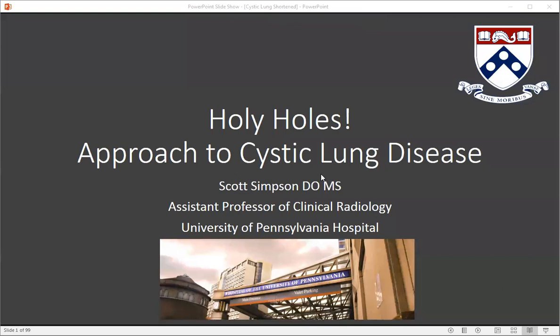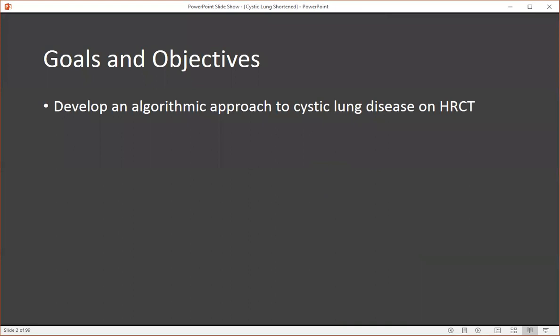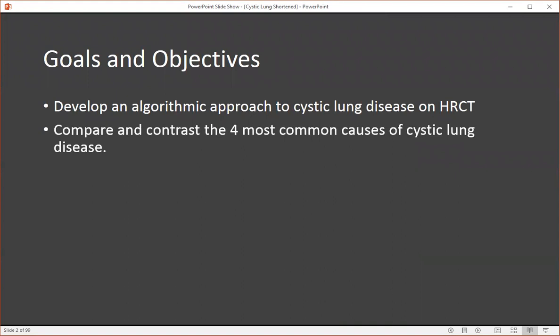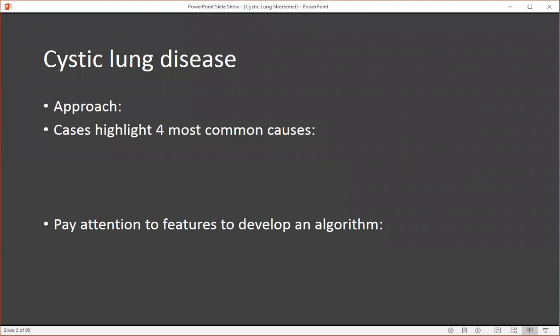Hi, my name is Scott Simpson, and this is Approach to Cystic Lung Disease on CT. The goals and objectives of this lecture are to develop an algorithmic approach to cystic lung disease on CT, compare and contrast the four most common causes, and then recognize secondary findings that may lead to a more specific diagnosis.